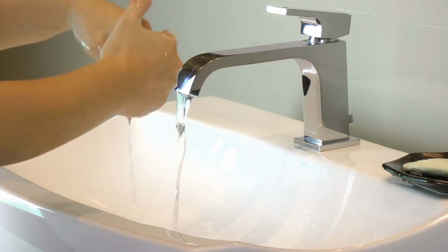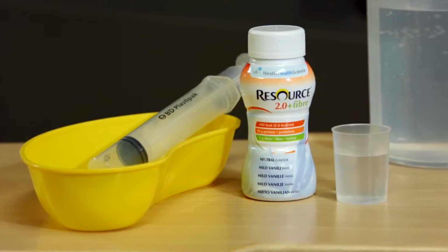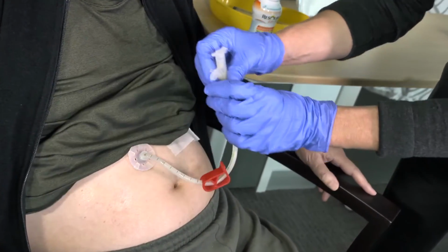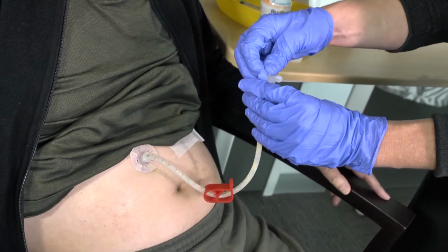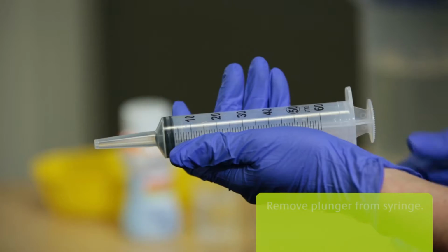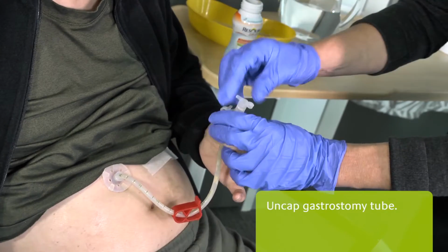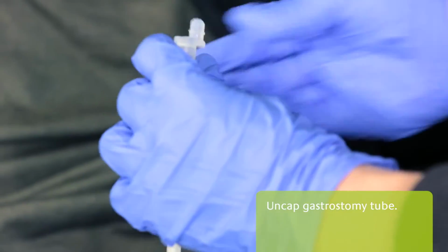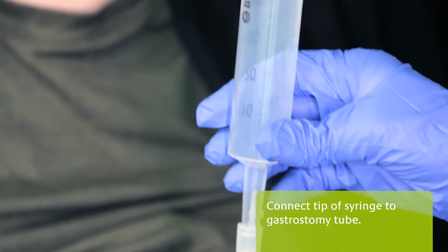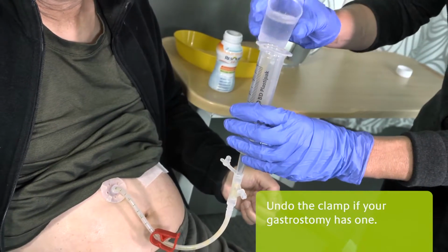Firstly, wash your hands. Assemble all equipment using a clean syringe. Then remove the plunger from the syringe. Uncap the gastrostomy tube and connect the tip of the syringe to the gastrostomy tube. Undo the clamp if your gastrostomy has one.